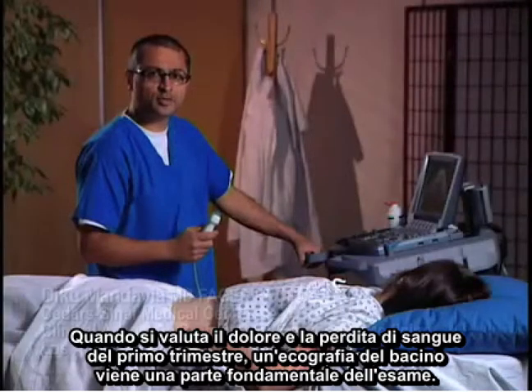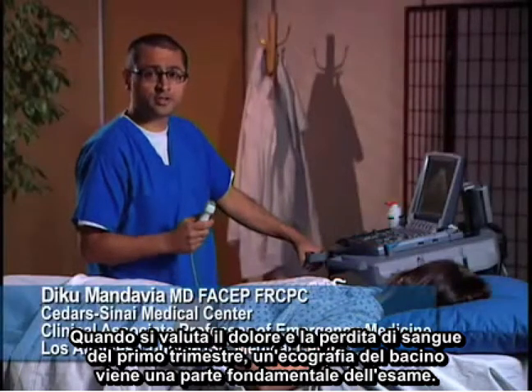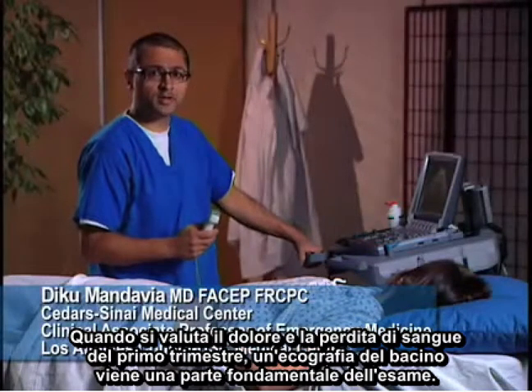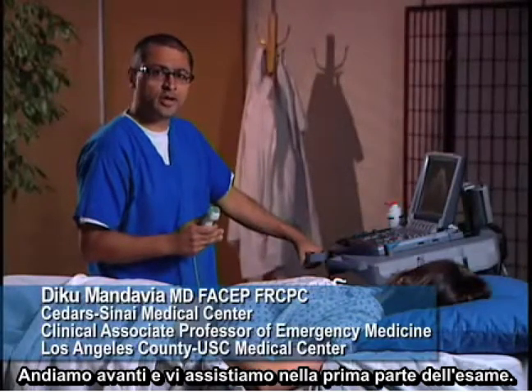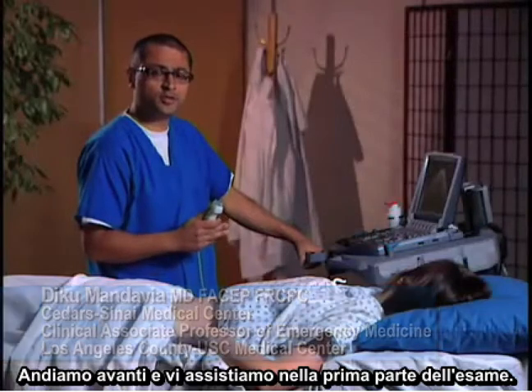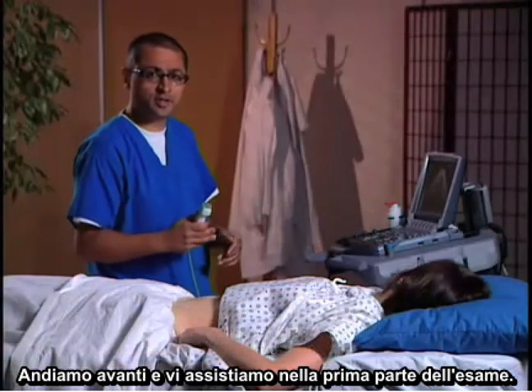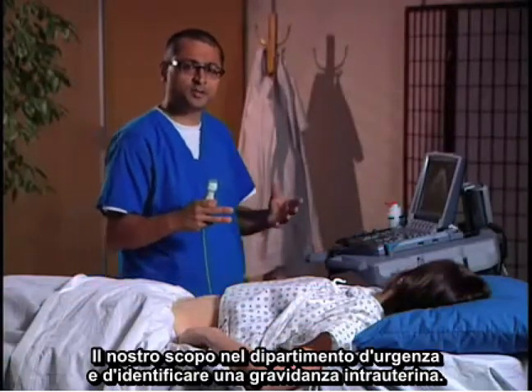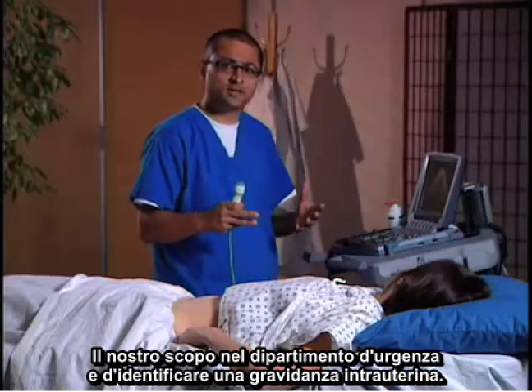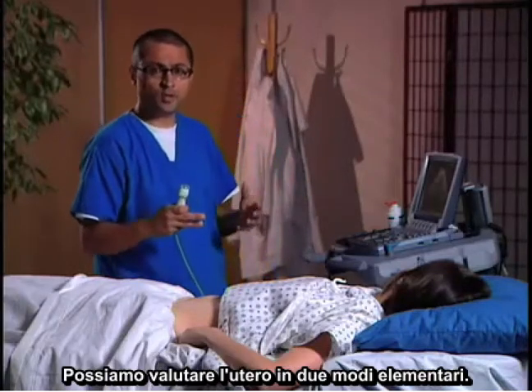In evaluating first trimester pain and bleeding, a pelvic ultrasound is a critical part of the evaluation. We're going to take you through the first part of this examination. Our goal in the emergency department is to identify an intrauterine pregnancy.